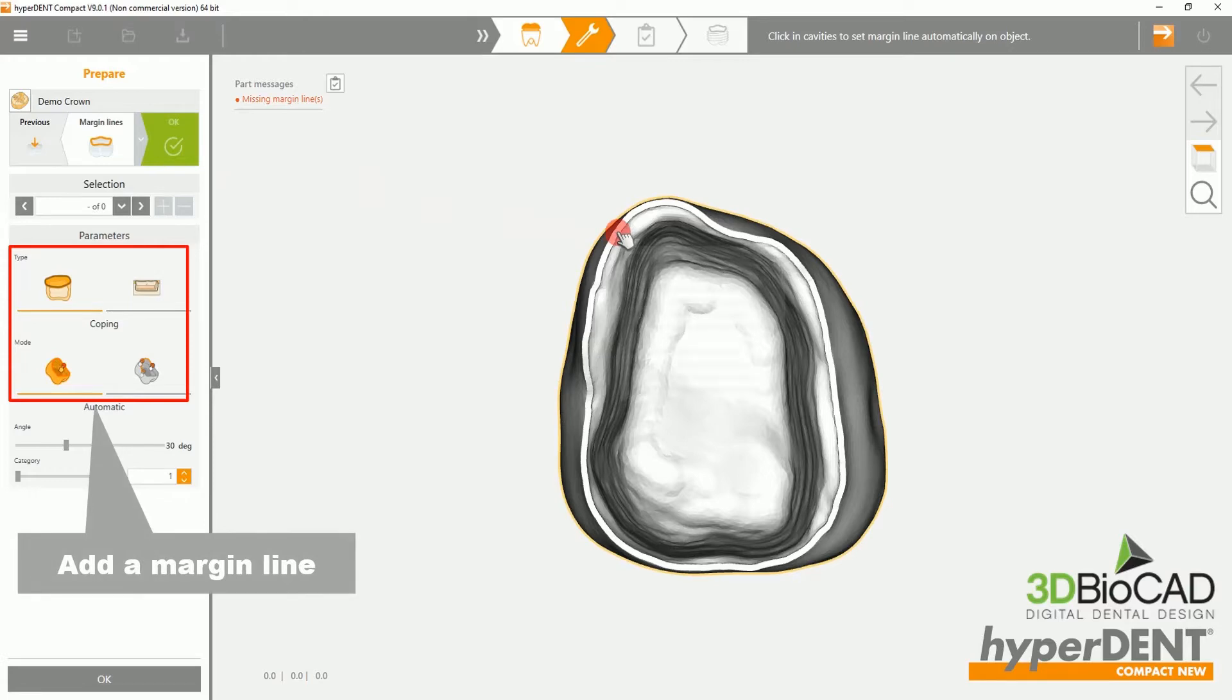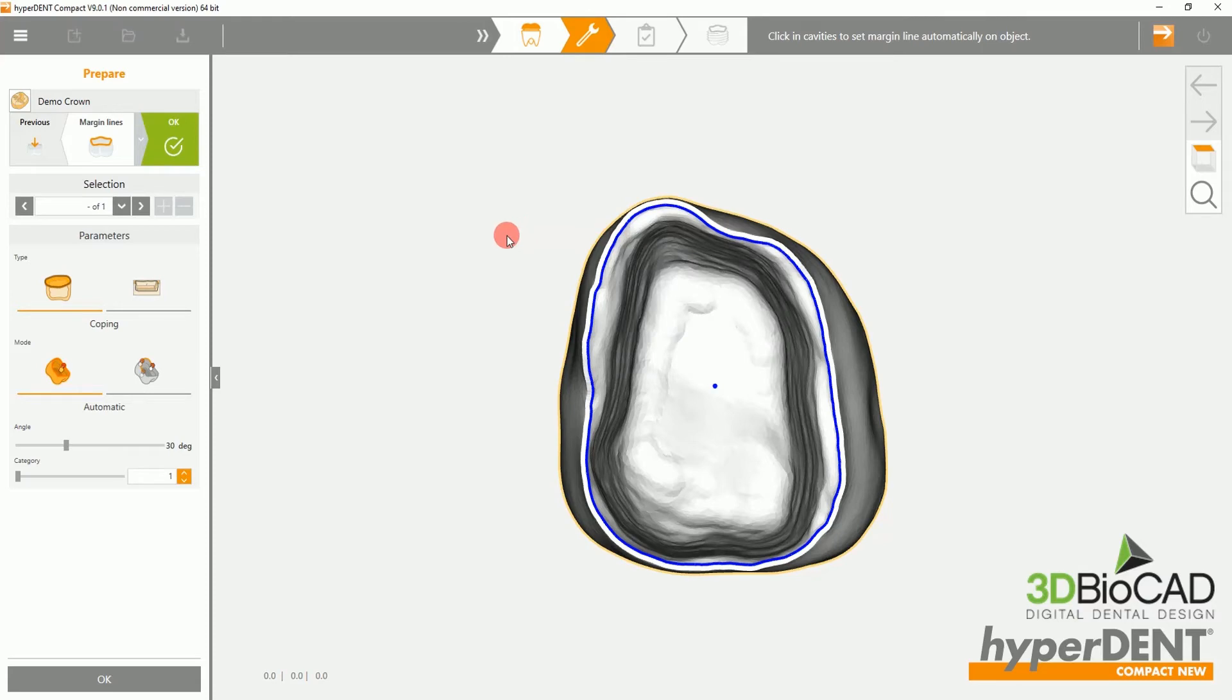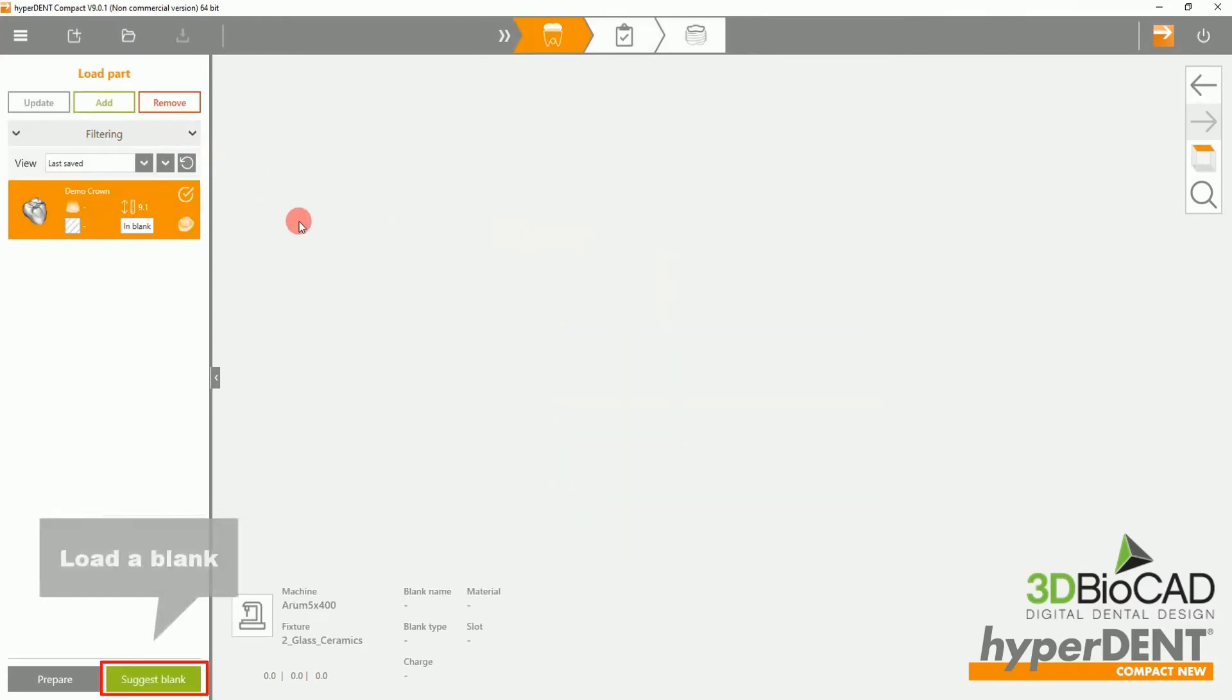Here, you will be adding a margin line. Click on the margin and the software will automatically detect where the margin line goes.